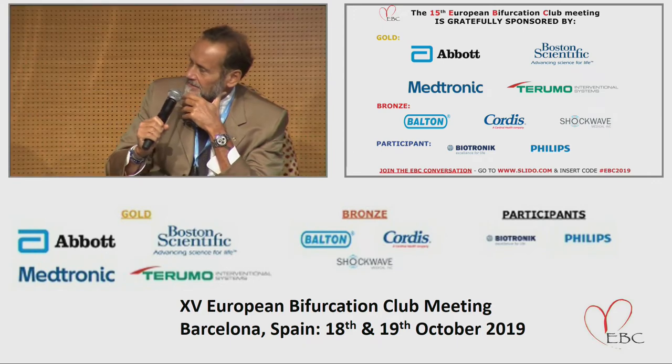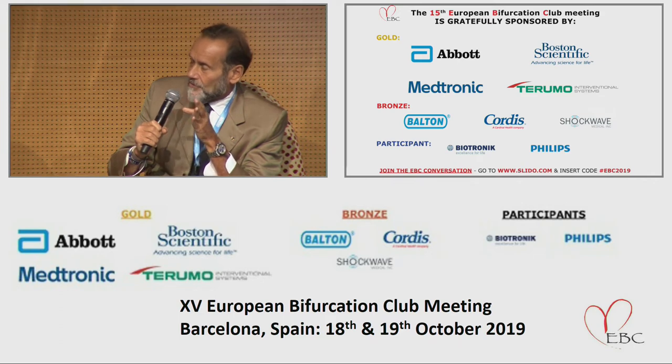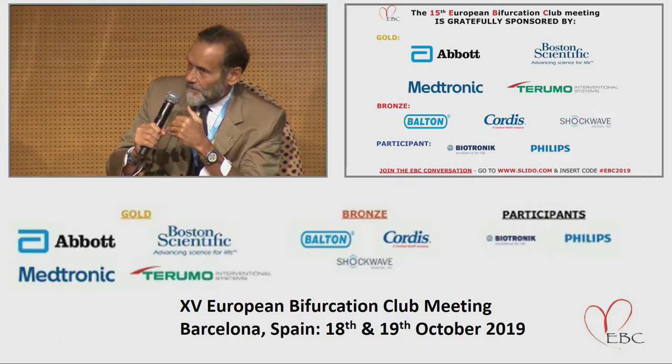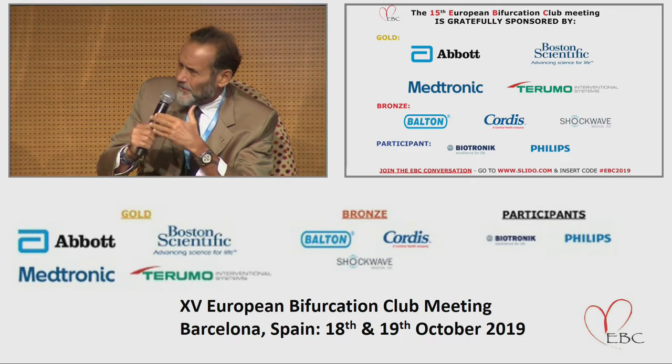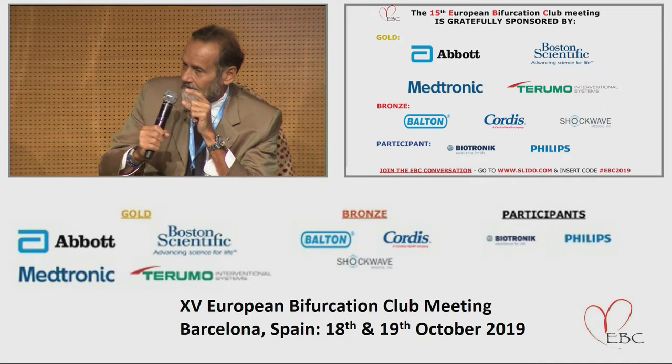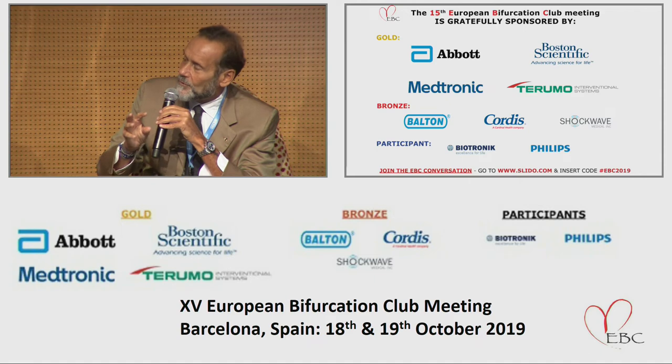Just a comment. The drug-coating balloon has been shown to be effective in a normal vessel. The problem is that the bifurcation lesion is a really challenging setting. The problem is, I think, the crossing of the struts. When you use a drug-coating balloon in a regular vessel, or even in-stent restenosis, you don't have the same trauma, and you cannot lose the drug. Thus, I think the real challenging setting for good results with drug-coating balloon is the bifurcation lesion. I agree with you when you say that you use a drug-coating balloon if you cannot use a drug-eluting stent. I think that is a good message.